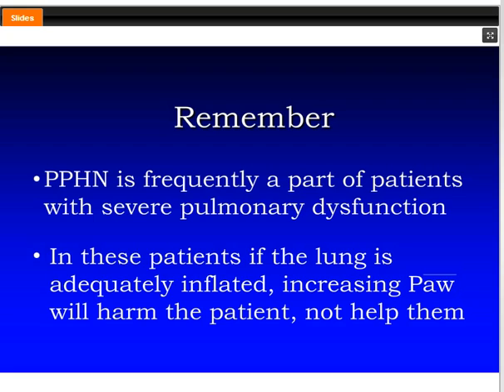Our first question is pretty topical. Right now, Dr. Null, there's a bunch of discussion going on on the AARC email list about suctioning on high frequency. These questions come up. It's probably one of the more common questions I get as product manager: do we suction with the frequency on, or do you pause the ventilator and suction with the frequency turned off?